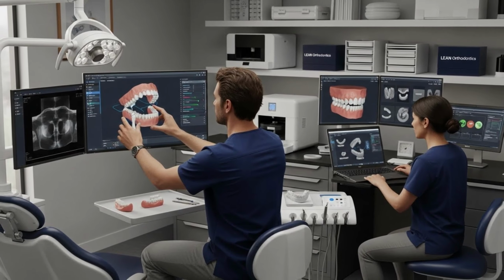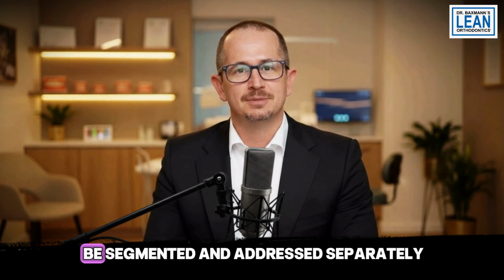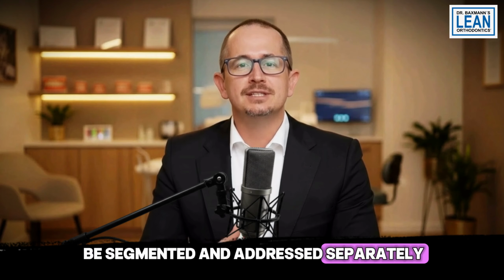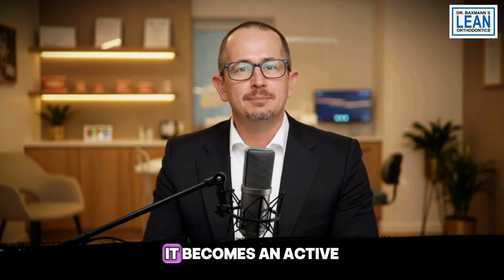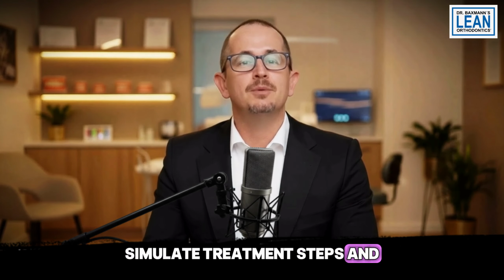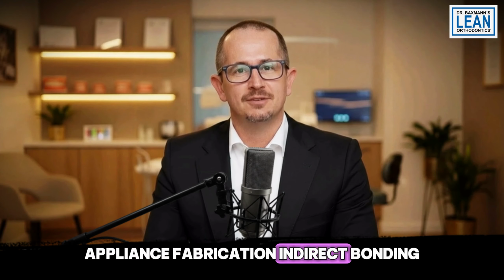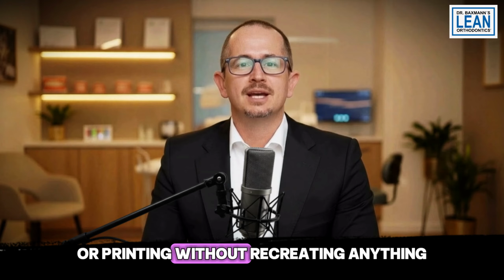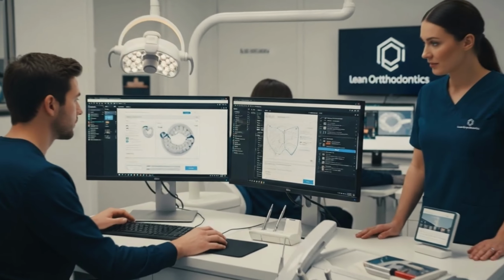Once the digital model is complete, it doesn't stay static. Each individual tooth can be segmented and addressed separately. That means the model is no longer just a visual record. It becomes an active planning tool. You can move teeth individually, simulate treatment steps, and prepare the model for aligners, appliance fabrication, indirect bonding, or printing without recreating anything.